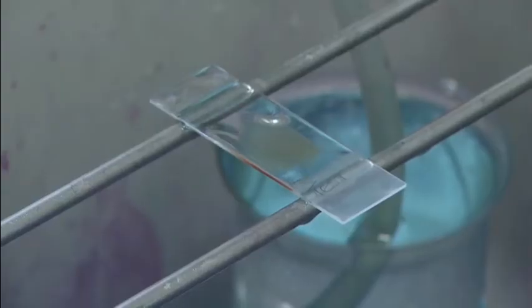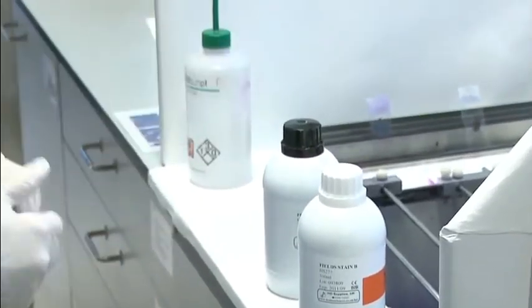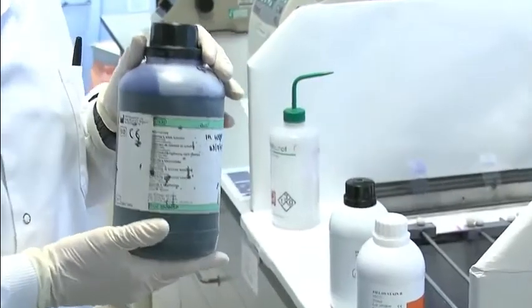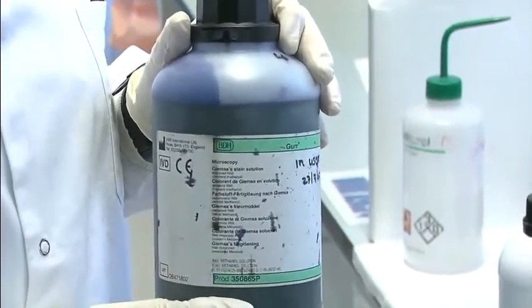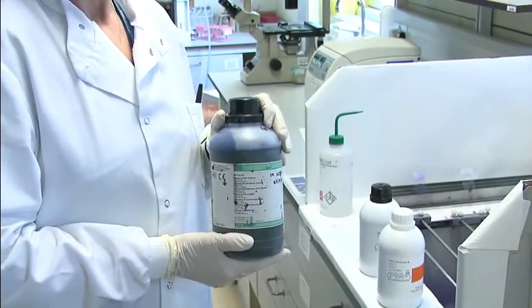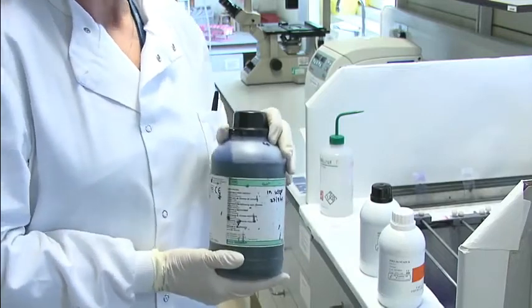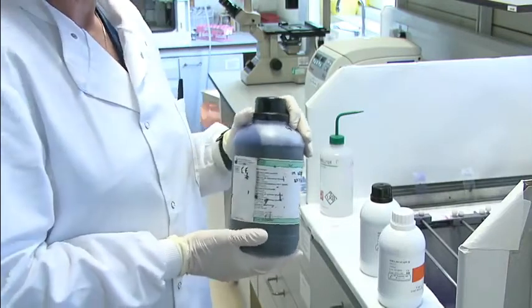For the Giemsa stain for the thin film, you would stain with Giemsa 1 in 10 in buffer pH 7.2. Haematologists use 6.8, but in parasitology for malaria you would use 7.2. The advantage of the Giemsa stain is it shows the stippling better, it shows a slightly better colour of the parasites and the red cells. But the advantage of the rapid fields is it only takes a minute to stain, whereas Giemsa takes half an hour. So you can say at least there's malaria there before you go on to the long stain, so the clinicians will have a quicker idea and can get towards their treatment more quickly.